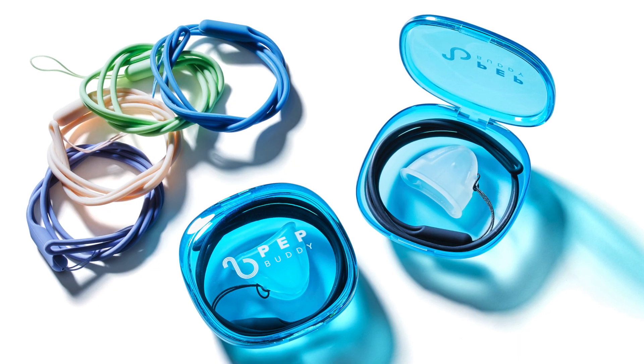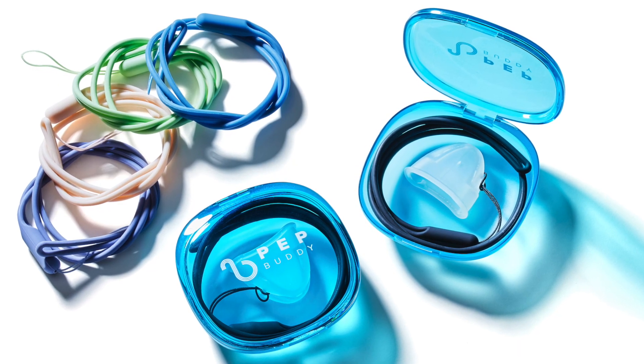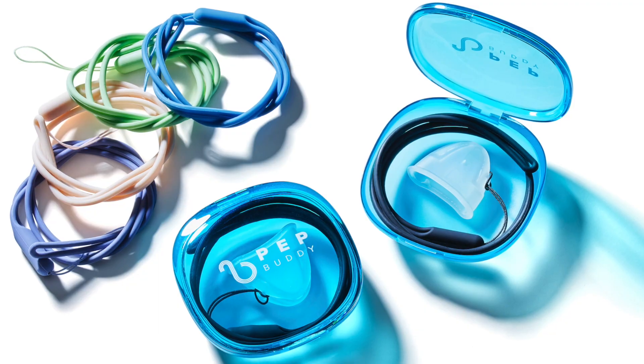If you use pursed lip breathing or if you already use a PEP device, Level 1, you might want to consider Level 2, because now you're ready for a higher pressure and even slower breathing. Most people prefer getting a bundle — that way you have both devices at a lower cost.